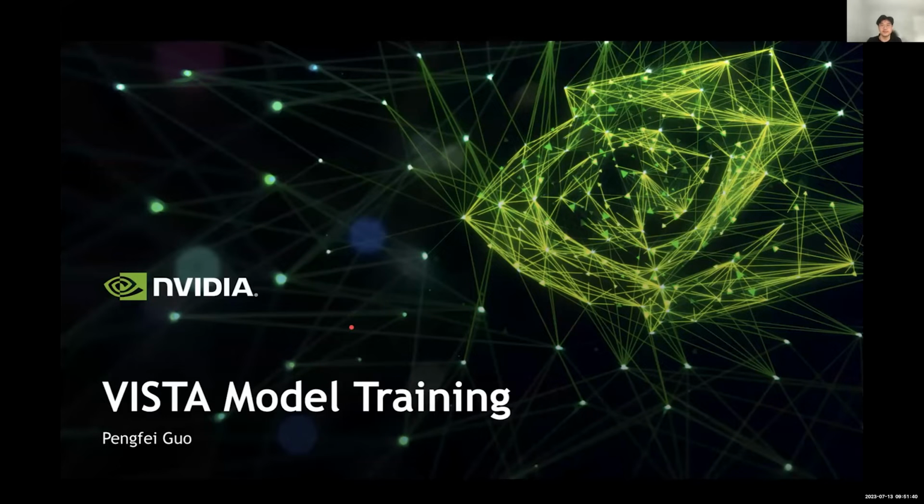Hello everyone, my name is Pengfei. I'm an applied research scientist at NVIDIA, and I will continue the presentation and introduce more details about our MONAI Vista model.